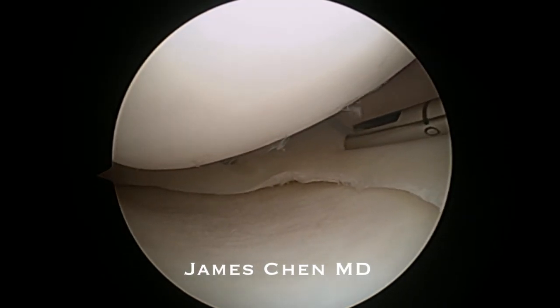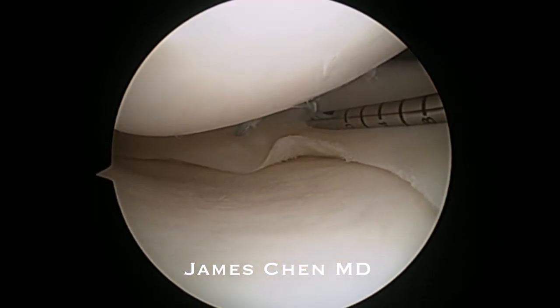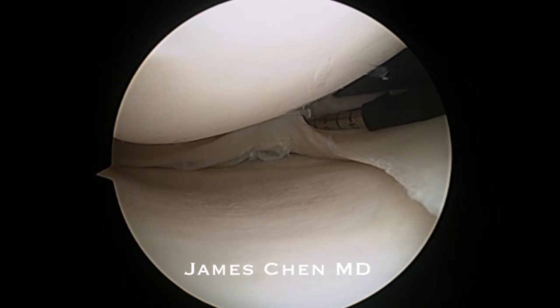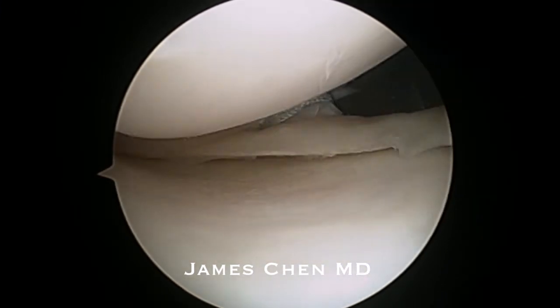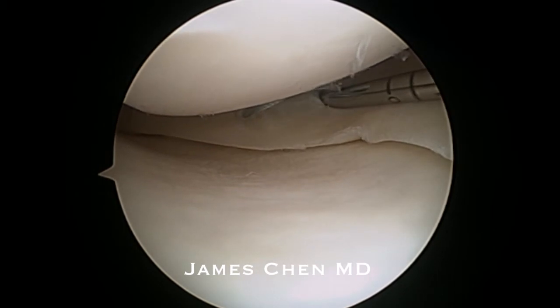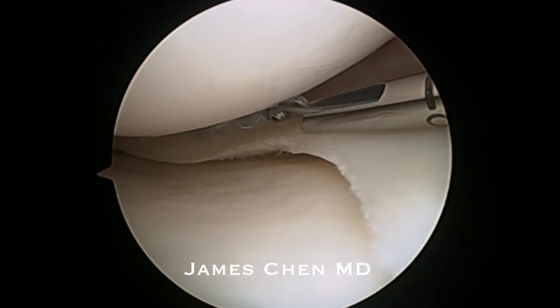I then insert the Speed Cinch back through the meniscus, puncture the joint capsule, deploy the mini anchor, withdraw it and then tighten the cinch knot.